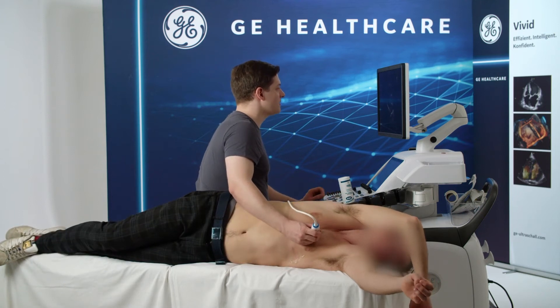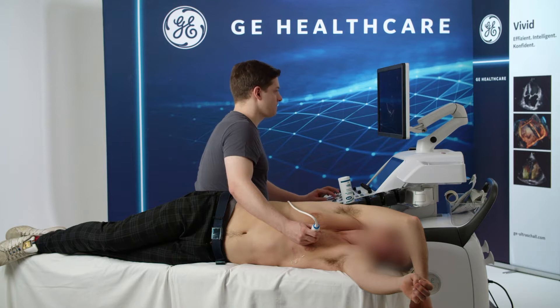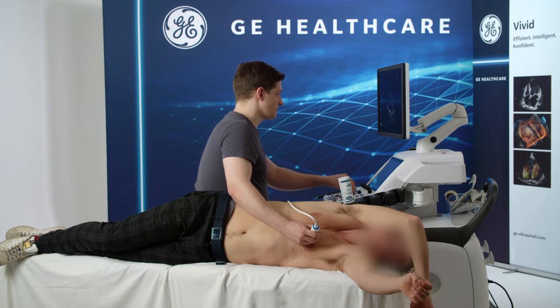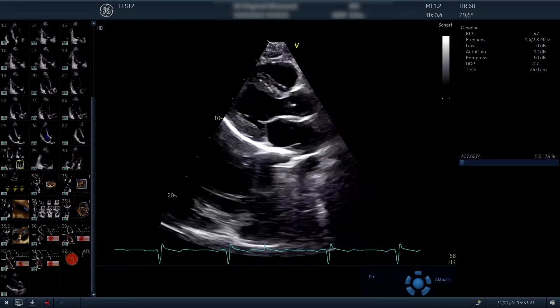We start with the parasternal long axis view. In the case of the parasternal long axis view, we start at the clavicular, go down intercostal spaces until we arrive at the third or fourth intercostal space. The marker is located to the right shoulder of the patient and that's the first view we get.